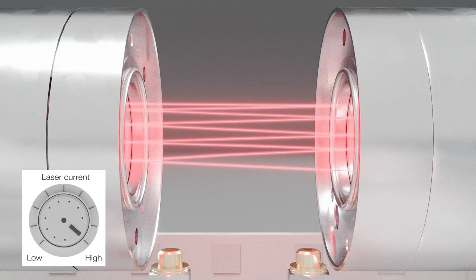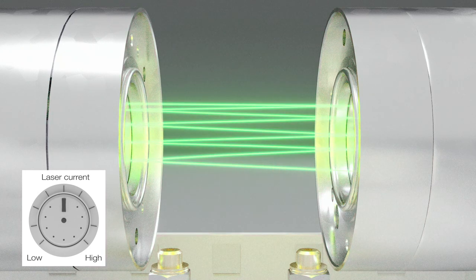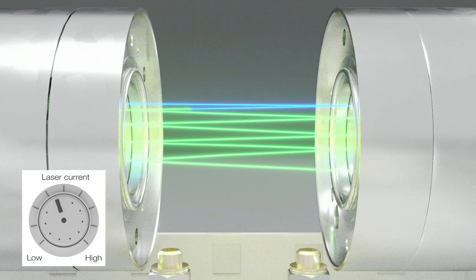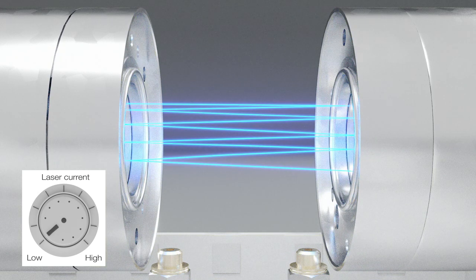The laser beam is tunable in a range of a few nanometers by varying the laser current or temperature. For this reason, depending on the spectrum, up to three gases can be measured with only one laser diode.